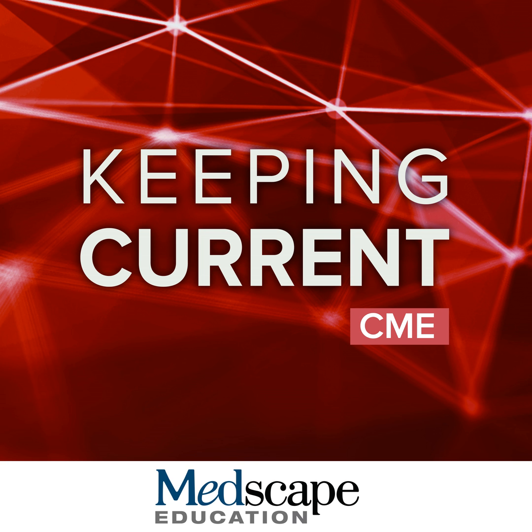A couple of things I just want to point out. First of all, with regard to the protocol, most of us do tend to use, in practice, anywhere from a dose and a half up to double dose of contrast. Increasingly, we're using single dose of contrast. Just bear in mind that if you do use single dose of contrast, you may want to image a little bit earlier post the contrast injection, and that lends itself quite well to shortening the protocol. So that's an important point to remember.